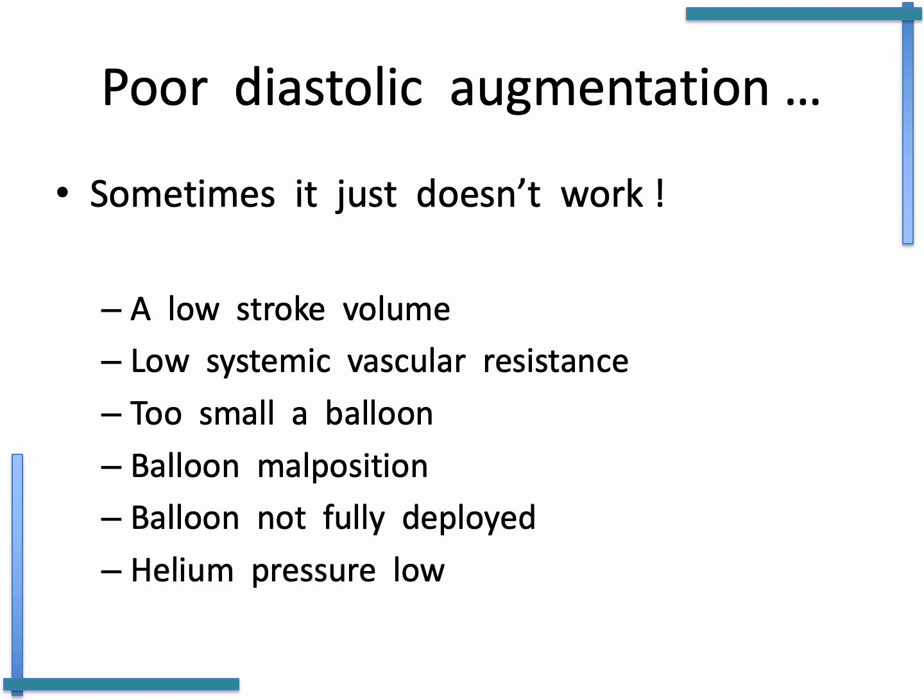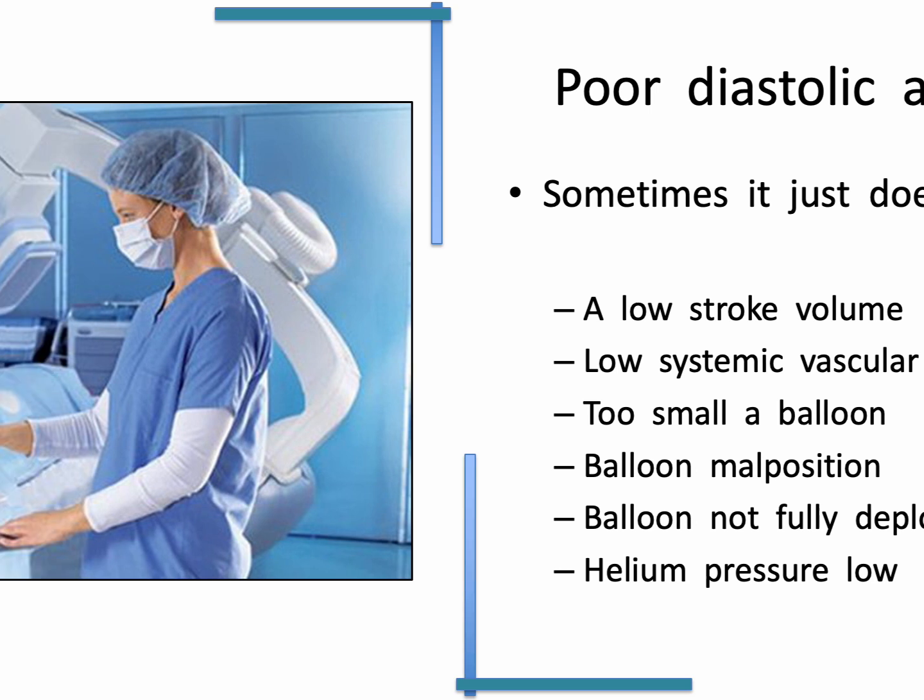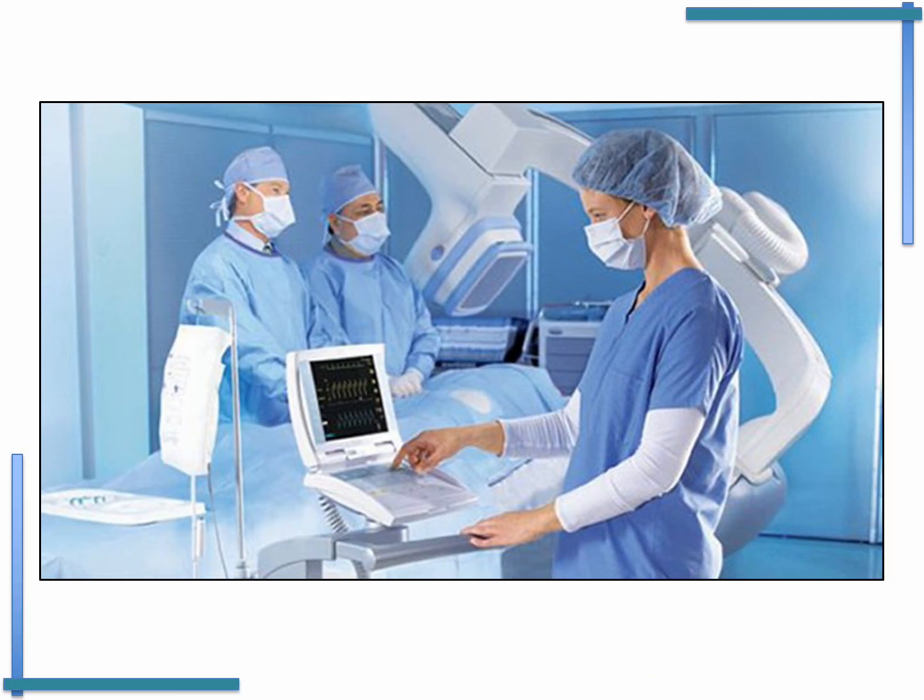And the last two factors there would be that the balloon's not fully deployed, so it hasn't been filled completely with helium, or that the helium pressure is low. So that brings me to the end of the talk, and it's just to say that we do expect you to know something about balloon pumps. They're not that uncommon in our clinical environments, in ICU and in theatre, particularly in the scenario of acute coronary syndromes and coronary artery bypass grafting.